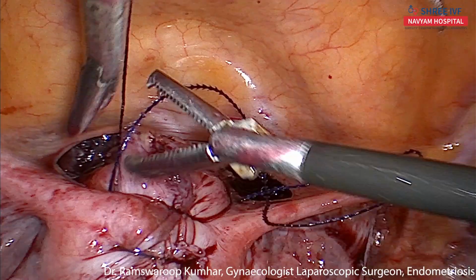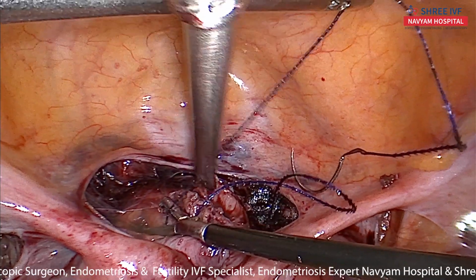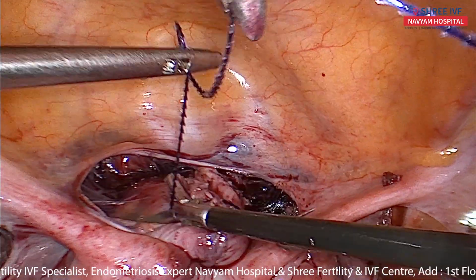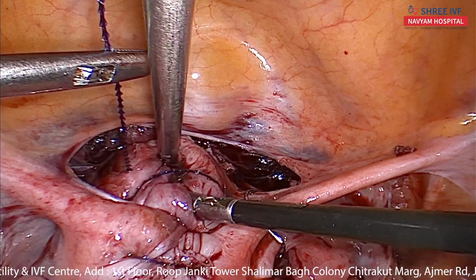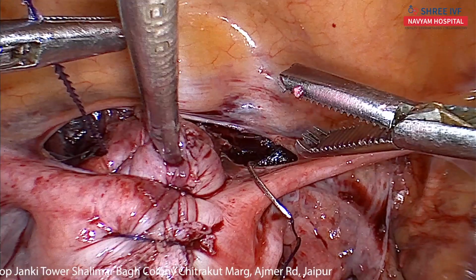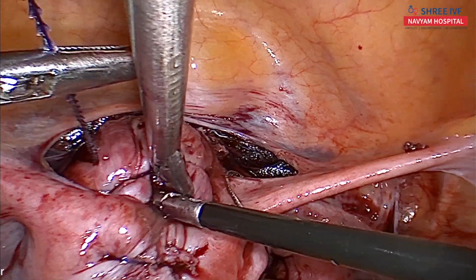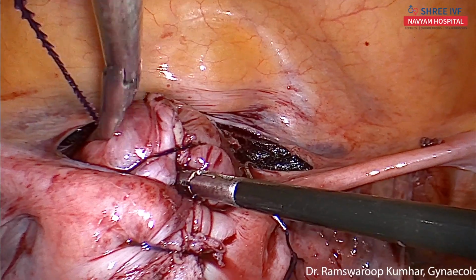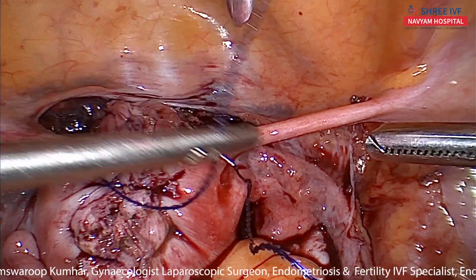Suture is stuck. Okay, leave it once. Little, leave it. This tissue should go inside so that a lesser amount of the raw surface should be present.